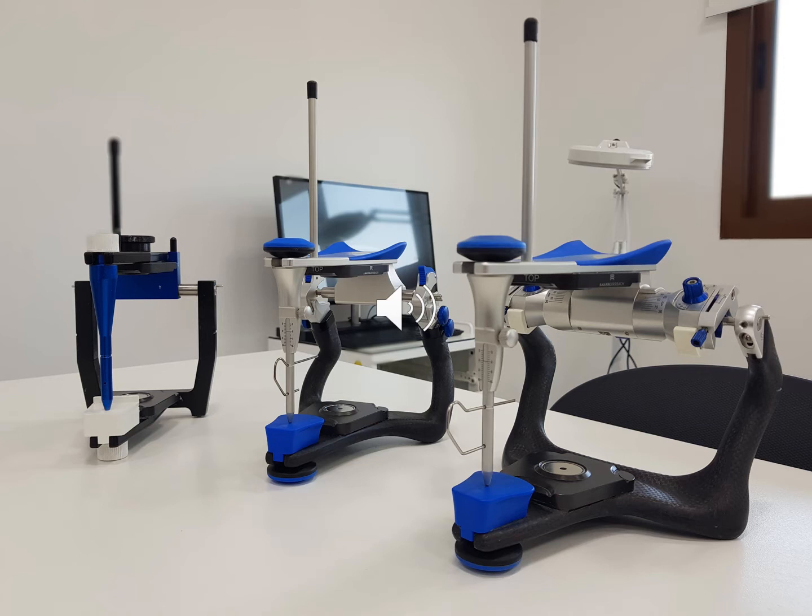Even though it might be called a fully adjustable articulator, there is no 100% fully adjustable articulator except for the patient's mouth himself. That is the most fully adjustable articulator that follows and resembles the mandibular movement to the highest degree of accuracy.